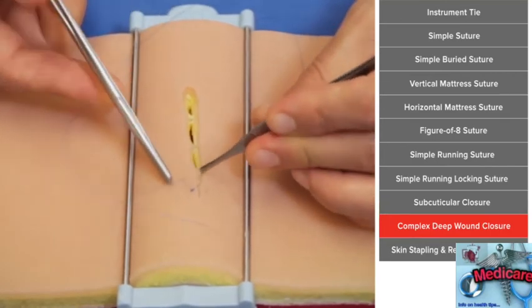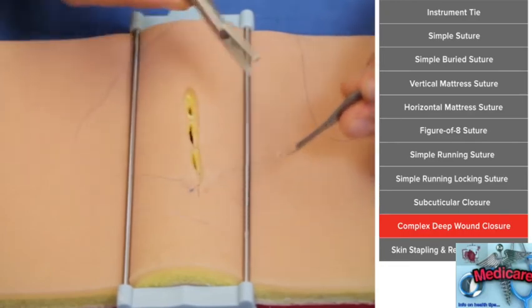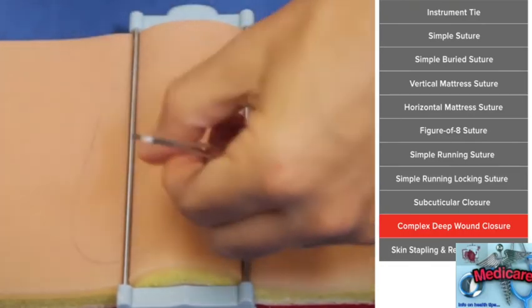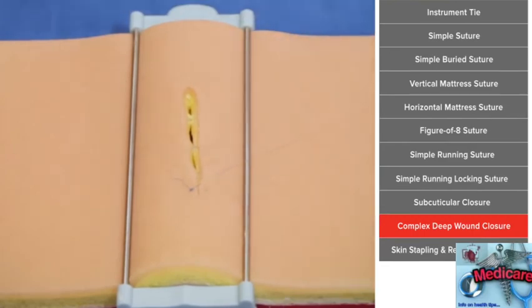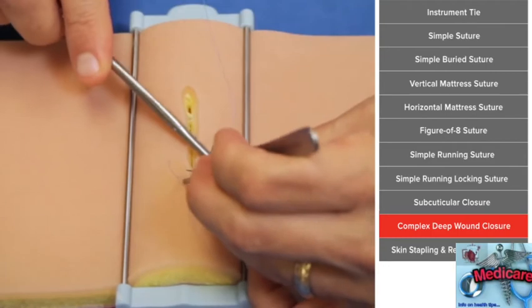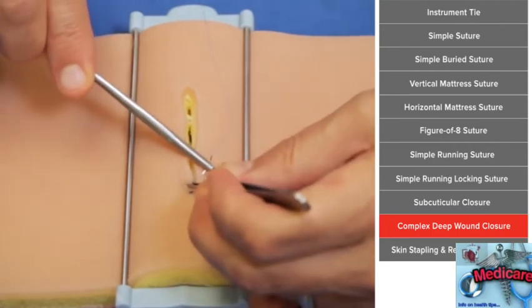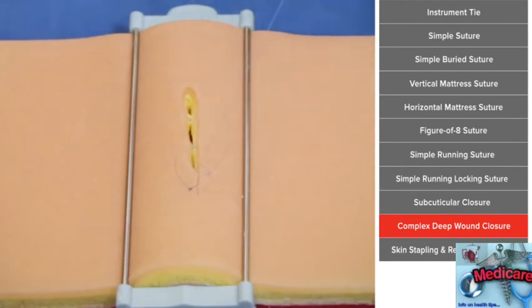I told you this is probably the best suture for wounds that are difficult to close and under a lot of tension, because you're grabbing a lot of tissue to a lot of tissue, and because you're starting far away and because your second bite is close, what that does when you tie it, it literally everts the wound, and so the skin edges pout out, which gives you proper healing.